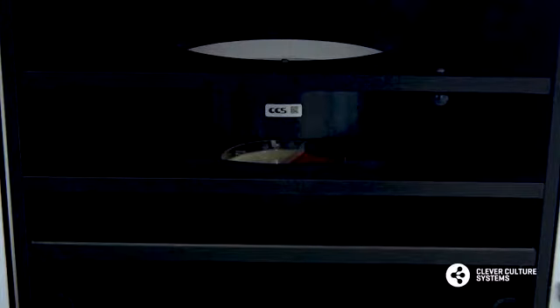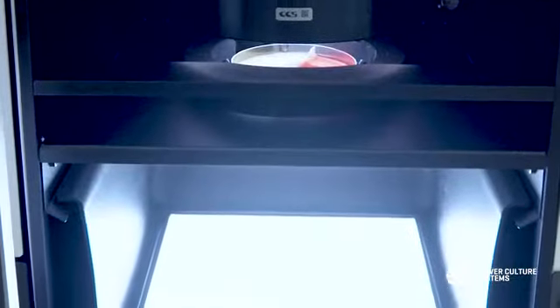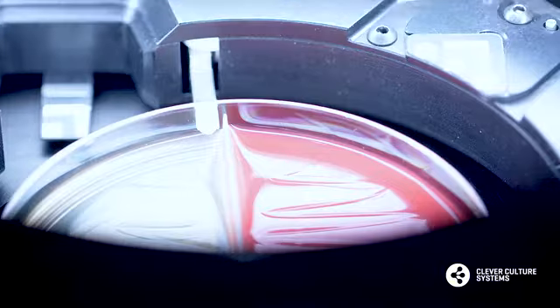So the imaging system was actually one of the most difficult parts of the development of the entire system. I think it's probably the part of which we're most proud in some ways. It seems very simple, but it's actually a very challenging imaging situation. APAS takes 2 different images of every plate, a top-lit image and a bottom-lit image, emulating the process that a microbiologist would use in a typical laboratory.